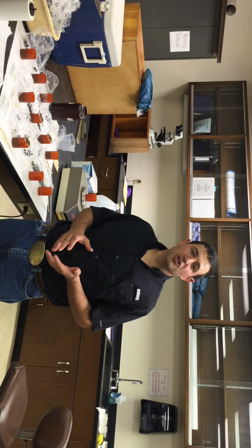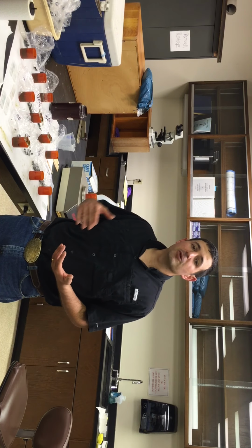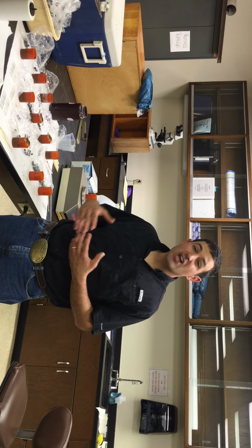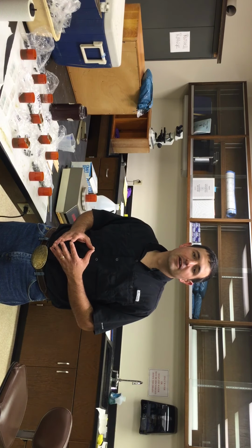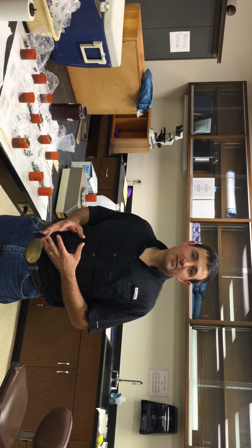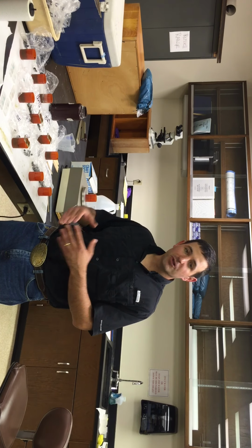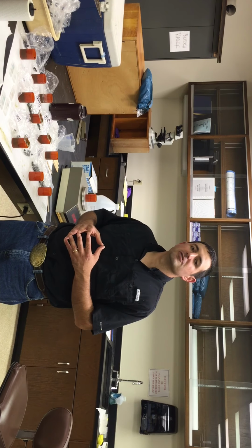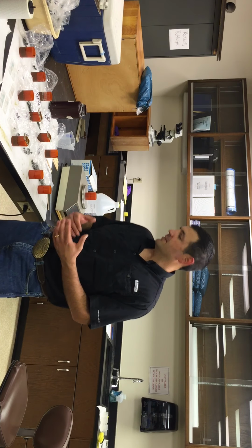So about the 1st of June, we weaned some Dorper ewe lambs. They were dewormed at that time, and they were turned out on pasture to be challenged against parasites. And then 45 days later, which was actually the first part of this week, we started to see some evidence of parasitism in those ewe lambs. So we went ahead and collected a sample from everybody. We're going to read that, and that's going to allow us to determine the genetic propensity or the differences in those animals for parasite resistance or prevalence in this case.